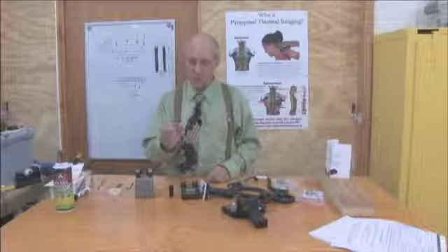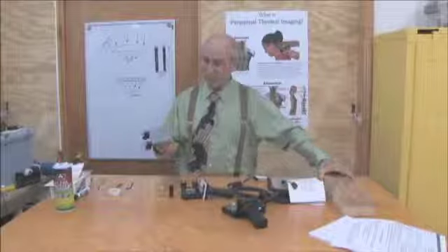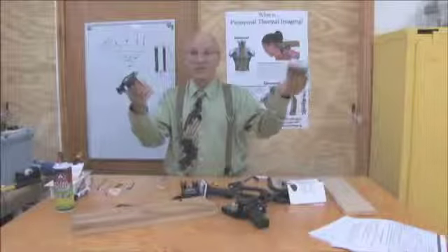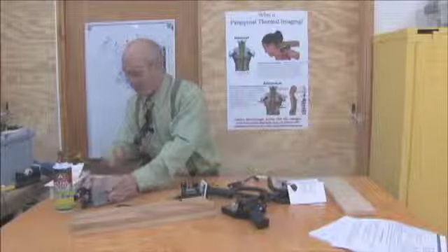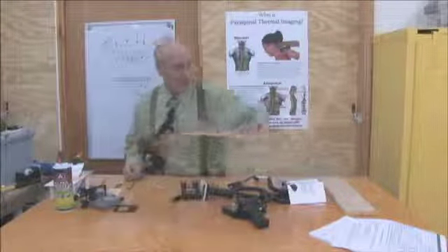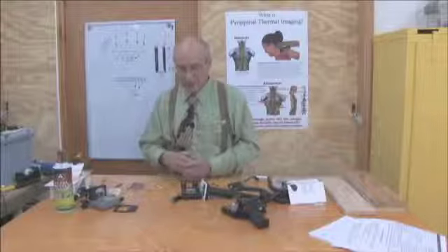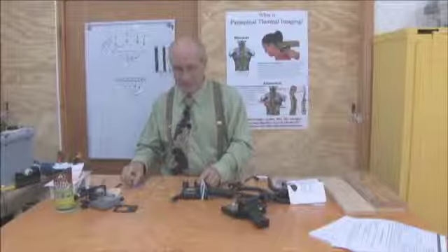So these screws will shear off if the scanner is dropped, and we'll try one here. It's pretty solid, but it can happen. There. Don't get upset. We can fix it. So if that happens to you, and it's in the middle of the day, or someone breaks the scanner in the evening while they're cleaning your office, which happens, if it's pulled off its holder, those screws will shear off, and I'll show you in a little bit how to get them out.